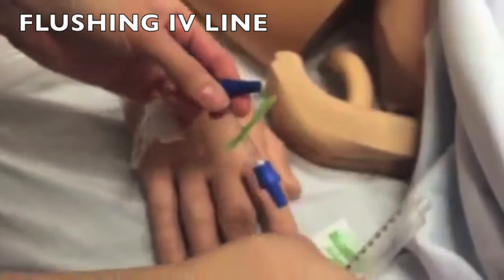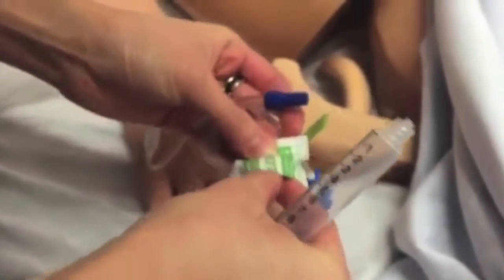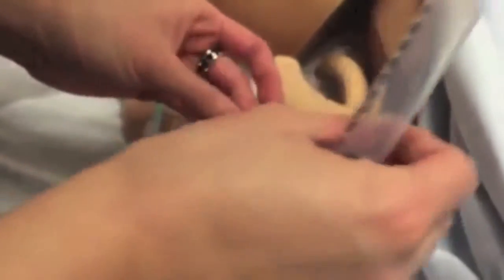Saline or sodium chloride is used as a sterile solution to flush out and remove any IV medication from your catheter.